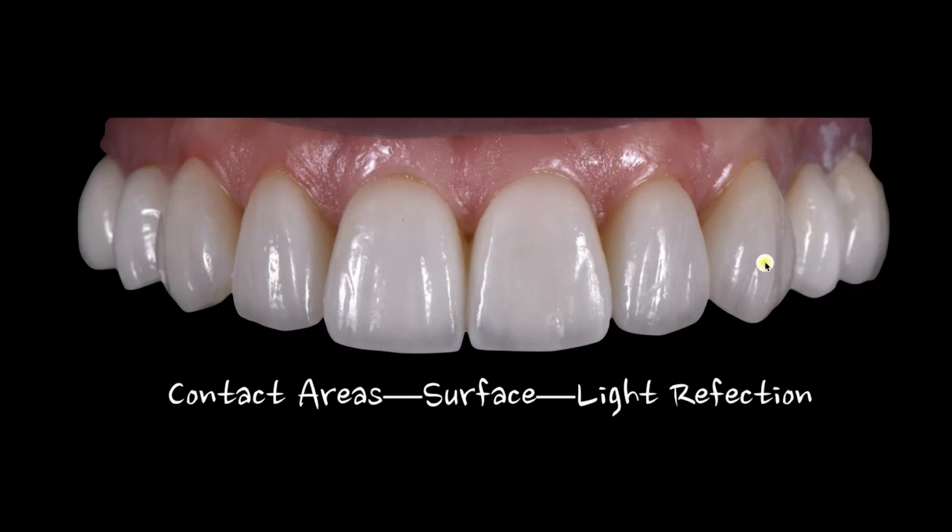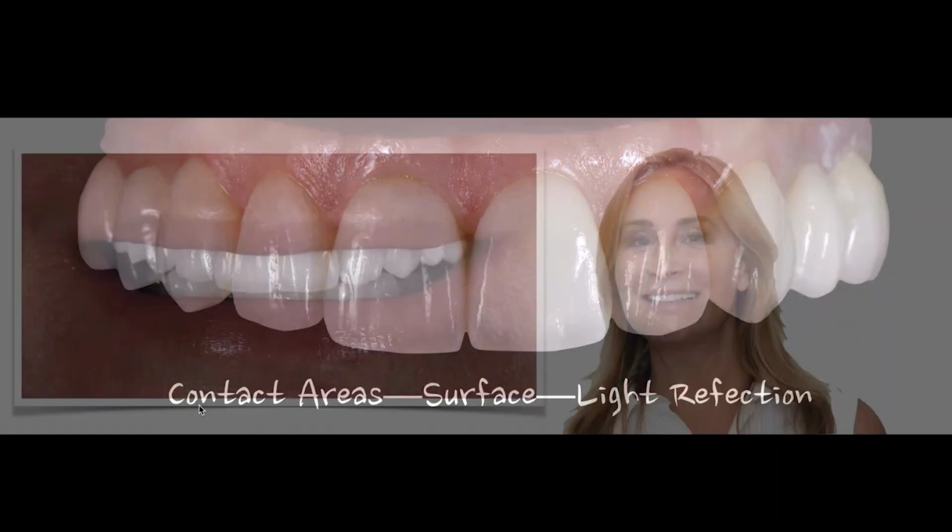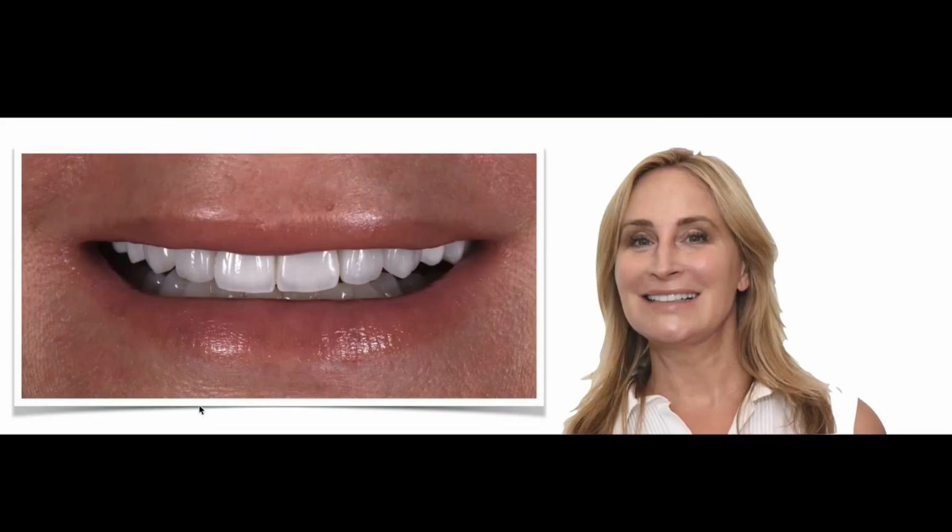Peaks on the cuspid, see where the light reflects. So all of those little details, even though they're super white and bright and not tons of translucency, are what make those work, those little details of light reflection there across the board.